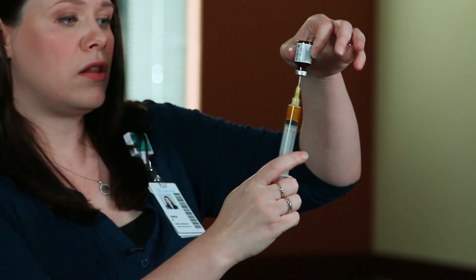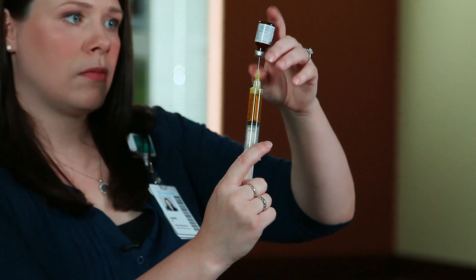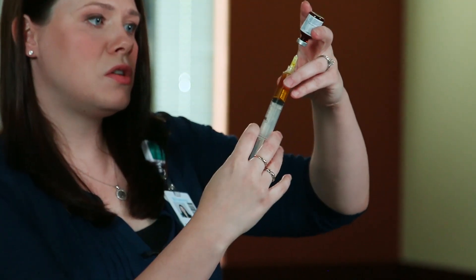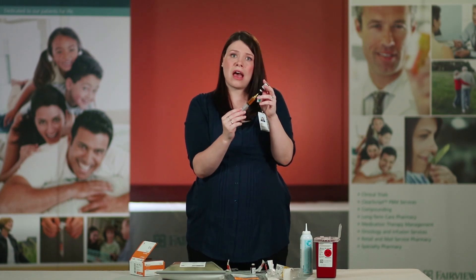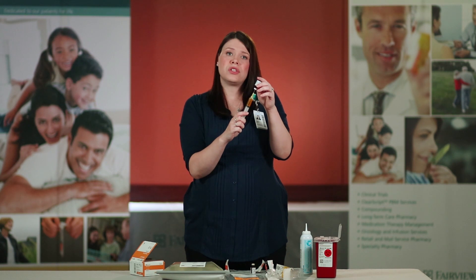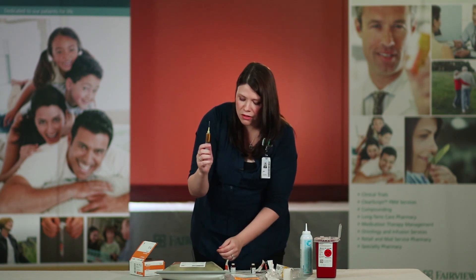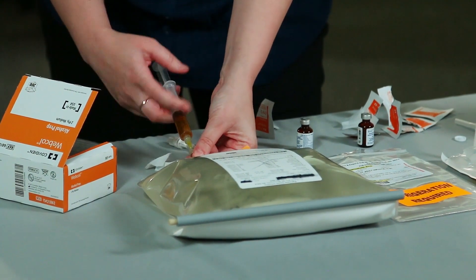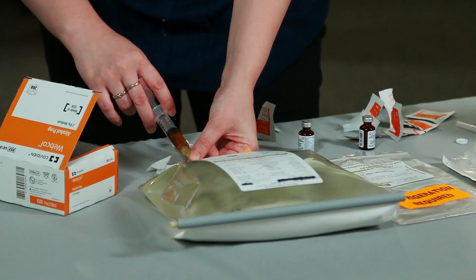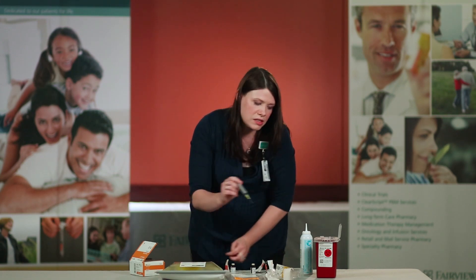Allow the liquid to fill the syringe. If you notice any air bubbles, flick the syringe and push up. It is good to note that you may have some small air bubbles — that is okay; you just want to remove the larger air bubbles. Remove the syringe from the vial, place it directly in the center of the TPN port, administer all of the medication, then remove the needle and dispose of it in the sharps container.